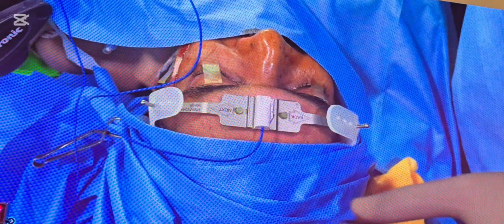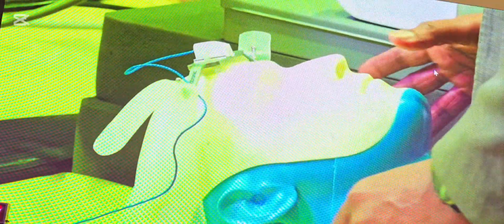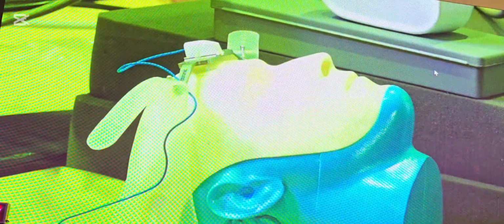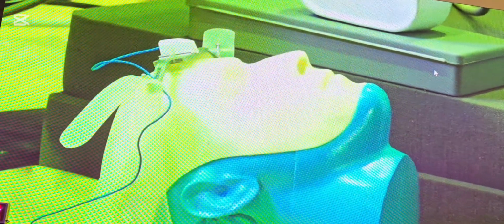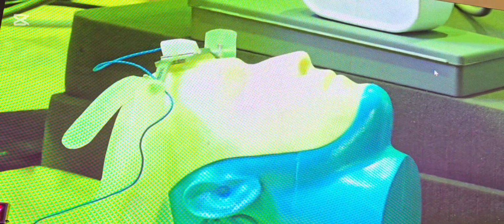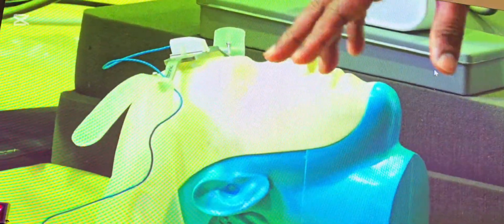Can you focus here? This view. External camera. Zoom out a little bit. So basically, the navigation system helps us to identify and compare with our CT findings to know the exact place and position of our instrument.